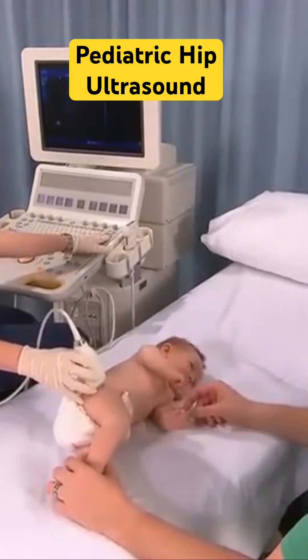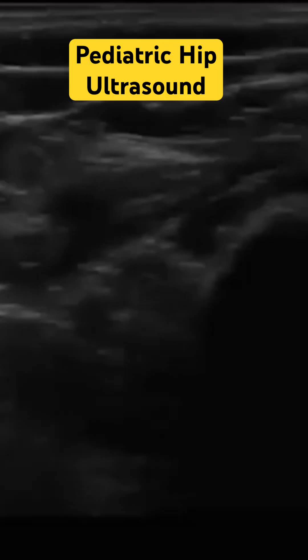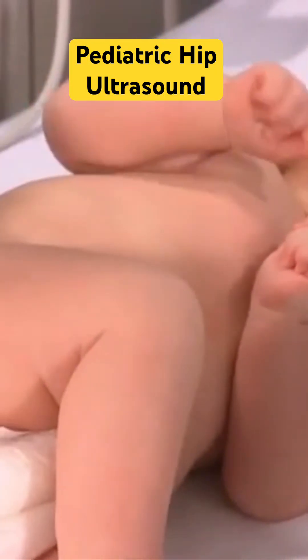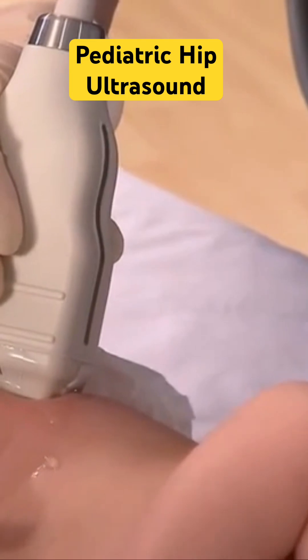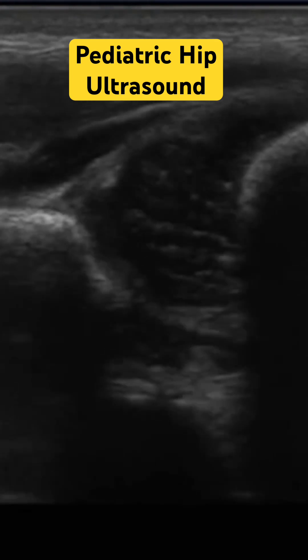Perform a survey scan and make any adjustments to maximize the image quality. Place the transducer on the lateral aspect of the hip while in the coronal plane to image the hip in a neutral view. Obtain an image of the femoral head within the mid-portion of the acetabulum.